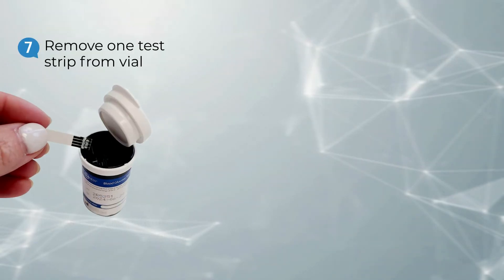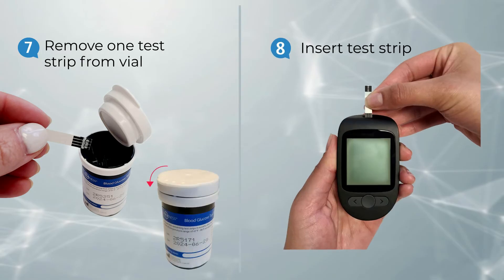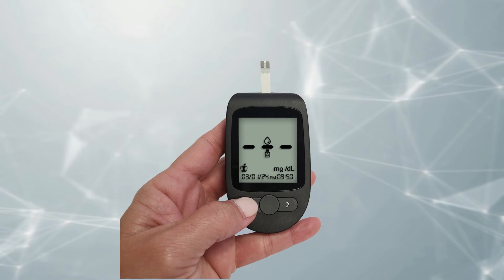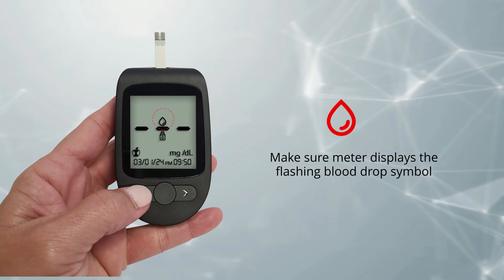Next, remove a test strip from the vial and immediately close the lid. With the meter off, insert the test strip contact end — contacts facing up — into the test strip port. The meter will turn on automatically. Make sure the meter screen displays the flashing blood drop symbol.